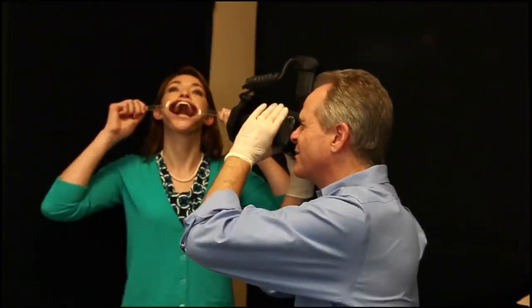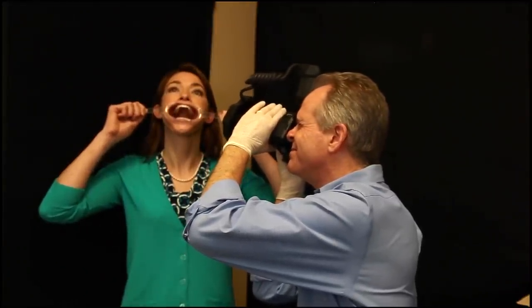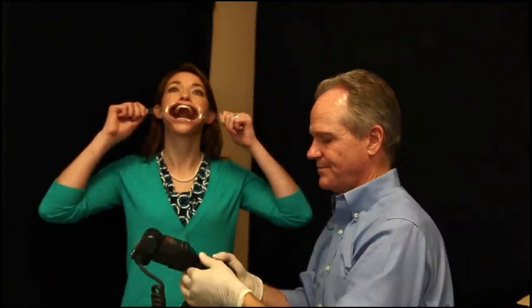After giving Julia a little break — consider patient comfort — the next shot is the sagittal occlusal view, which shows us cusp form. Set that up by having the patient turn at 45 degrees, tip the head up. I found it easier to come down and kneel because you're shooting up at the teeth at this angle. Open as wide as is comfortable, and that's about it.